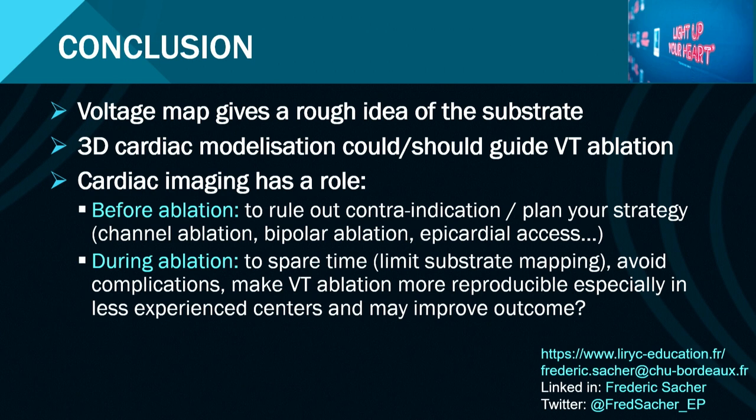It gives you a lot of information during ablation, so it seems to spare time, limit substrate mapping, avoid complications, and probably, and at least this is the way I'm seeing it, make things more reproducible, especially in less experienced centers. And whether it may improve outcome, we are waiting for the randomized controlled study to say that. Thank you very much.